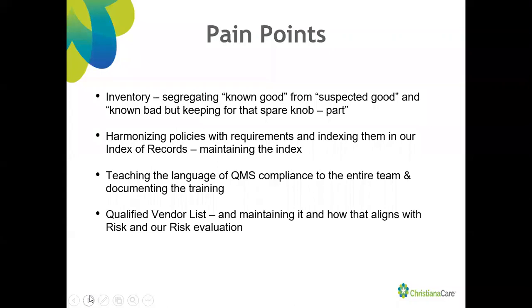That's great about HTMs. We're very resourceful. So for us, the segregation of parts we've taken to the point where some storerooms are all under one category. So like, I know I want a whole storeroom. Everything in here is new, it's known good, and we don't have to go through and tag each individual device and say all of these little parts in the room are excellent. I can just put a sticker on the door and say, if it made it into this room, we know it's good. And that also works with questionable places or parts that we know are defective.